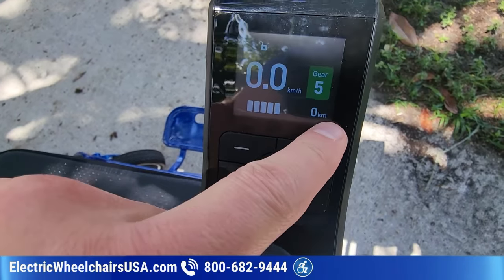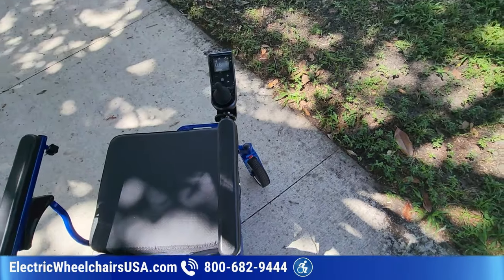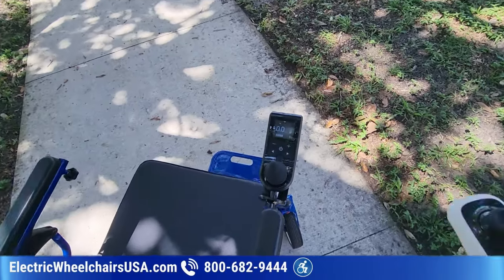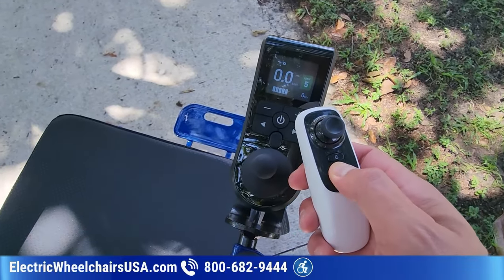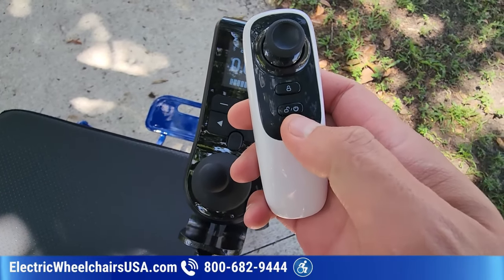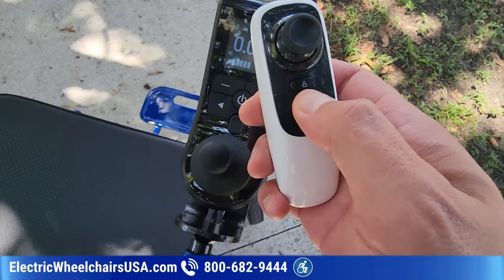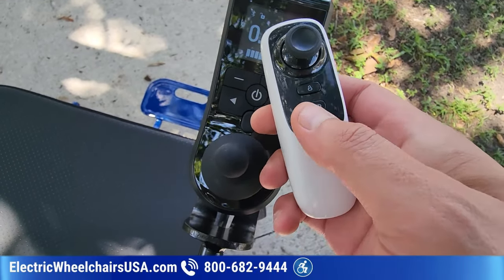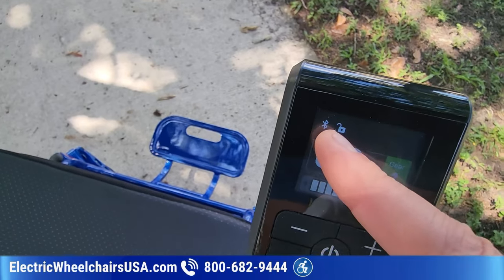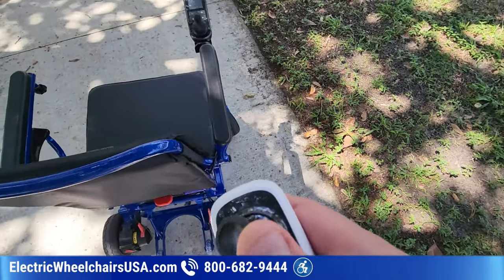We have your battery life. This is an odometer. You can see this says unlocked, so we can operate it with this. Now I can pair this remote with this, which is really nice. Now, a couple of troubleshooting steps. You can sync it by holding this power button down. There it showed up. I held it down, and now you can see the Bluetooth symbol shows up. That means this is connected, so now I can control the chair with this.